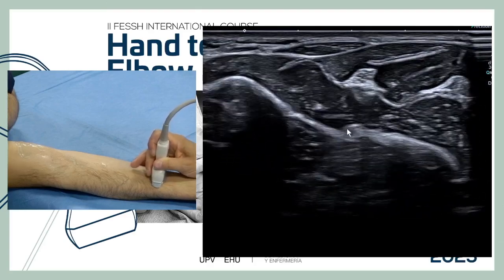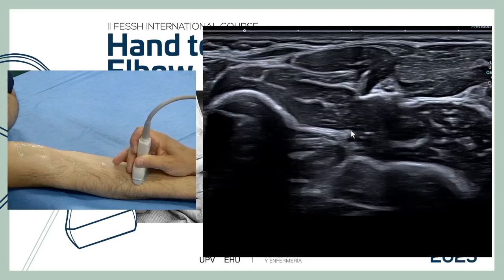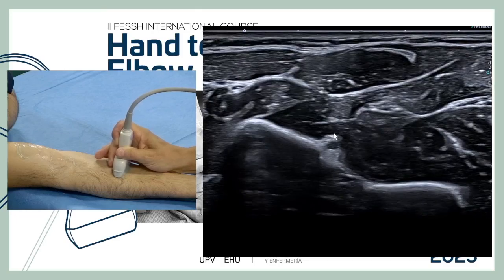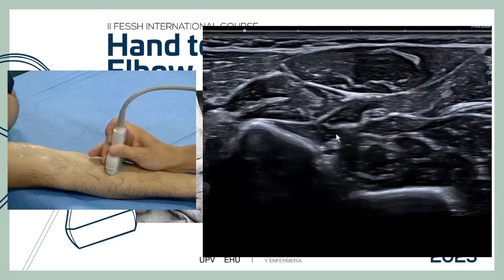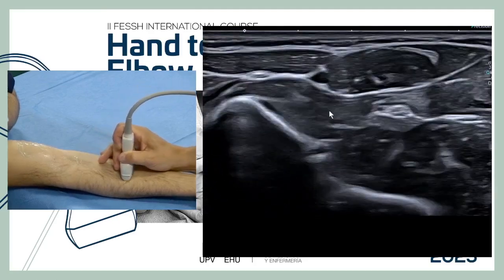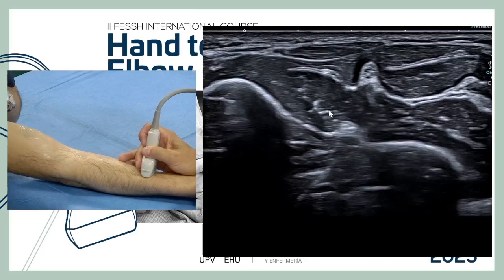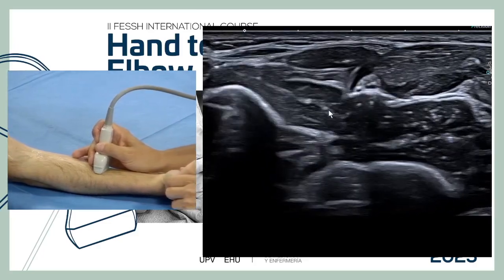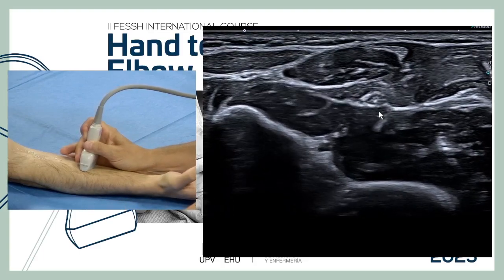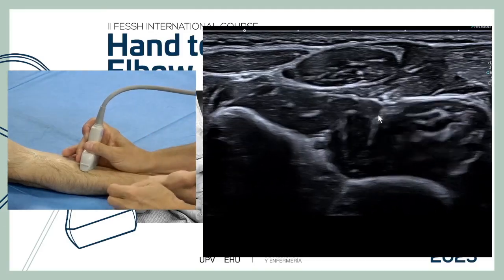We can usually see how the anterior interosseous nerve sometimes moves proximal to merge with the median nerve. We can observe it moving and rejoining the median nerve. It is also important to check the flexor pollicis longus with dynamic flexion, because sometimes there is an accessory muscle — the Gantzer muscle, present in about 70% of the population — that lies very close to the median nerve and is another potential site of nerve compression.